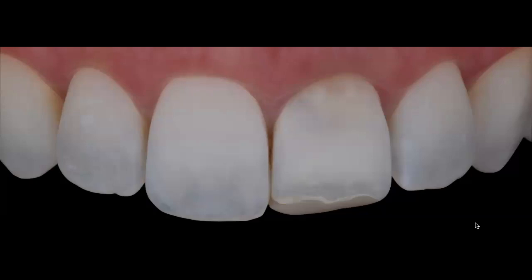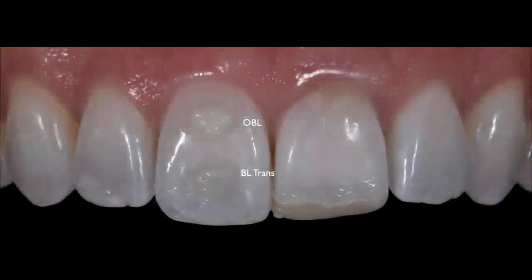So this is how I use that cross polarized photo, because it helps me understand what kind of substrates I'm going to have to replace, where to use more opacers, where I need to use a very flowable opaquer so that I can hide anything that I need to hide. It helps me create that map. And now what I'm going to do is select the restorative material. For this particular case, I chose to use Mirrors 2 from Coltene, which is an outstanding, highly aesthetic, direct restorative composite material. And that's what you're seeing here.